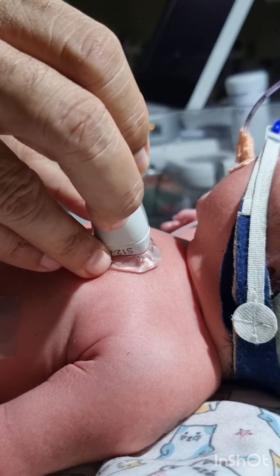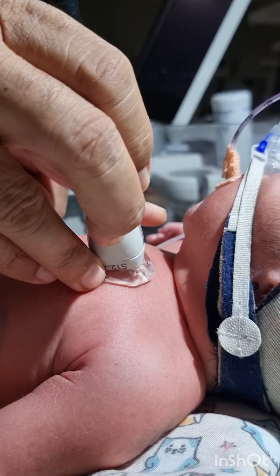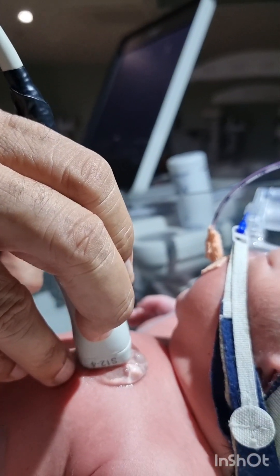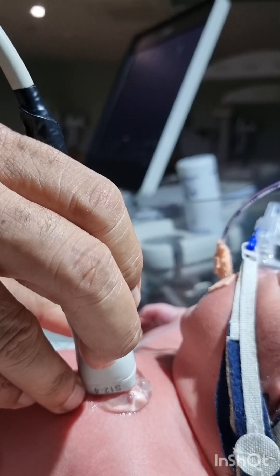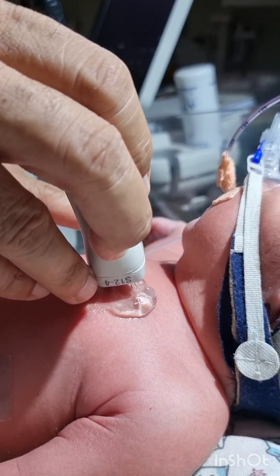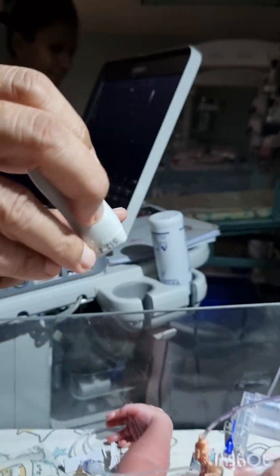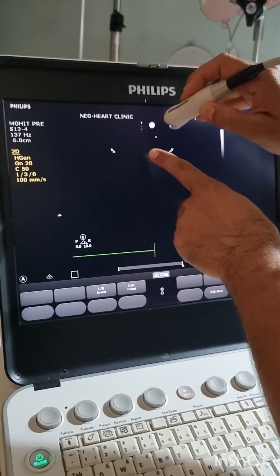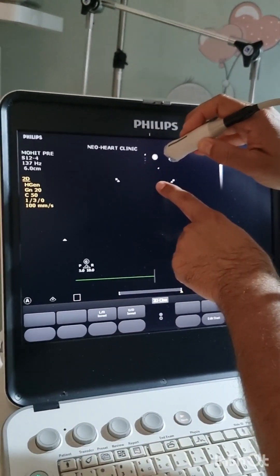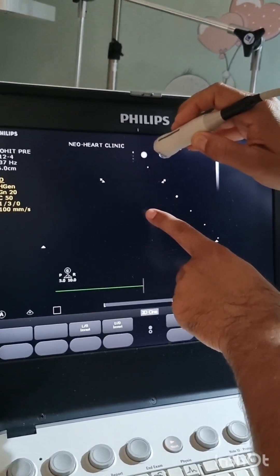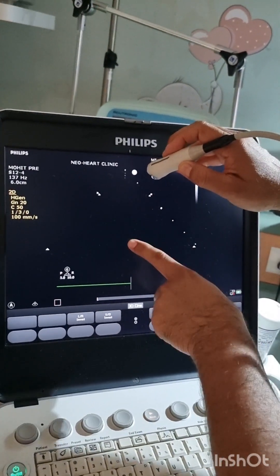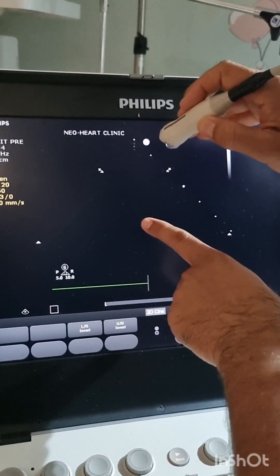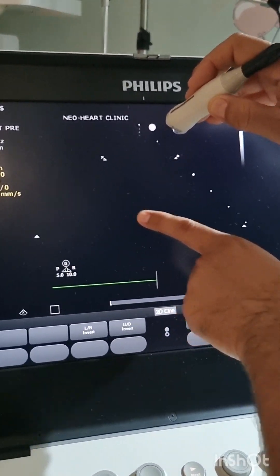The structures which will be nearer to the probe will be on the left side, and the structures which are on the right side will be away from the probe. So your aorta, which is on the left, will be seen here, and the SVC which is away from the probe on the right will be seen below the aorta.